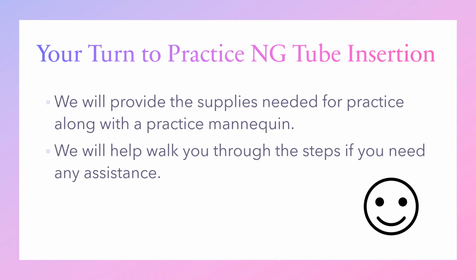Now it's your turn to practice NG tube insertion. We will provide the supplies needed for practice along with a practice mannequin. We will help walk you through the steps if you need any assistance.